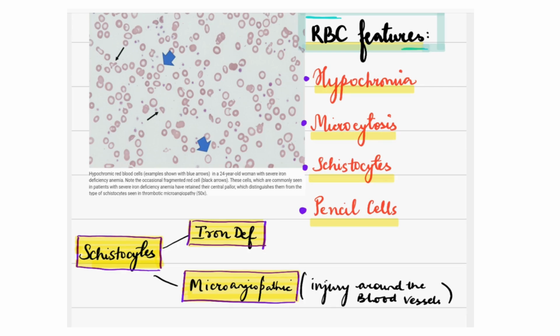All right, so in this picture particularly, what do you see? For example, I see that there is hypochromia, because I can see a lot of white. This hypochromia is moderate to severe according to me. Then I see small cells in comparison to a small mature lymphocyte, which is not visible on this screen. But as we grow and see thousands of cases, we know that this is microcytosis, even if there is no mature lymphocyte to compare with. So I see microcytosis. So definitely this is microcytic hypochromic.